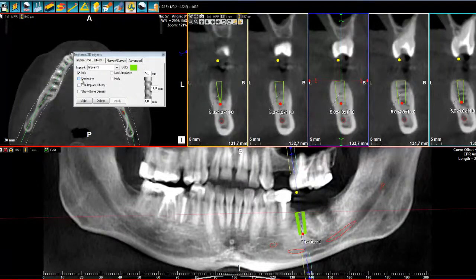And if you want to see the center line, just to be sure, especially when you put several implants together, you want to see that there is no offset in angle between one implant and the other. So once you're done, then you can simply lock it. That means that now I cannot change the angle, and this is also especially useful when you put several implants, because then you want to be sure that you're actually modifying the settings on one implant and not the other.